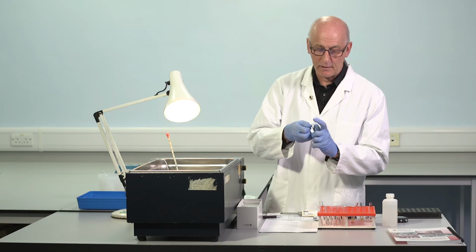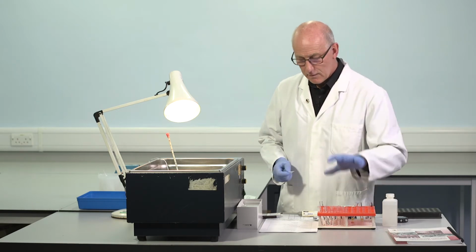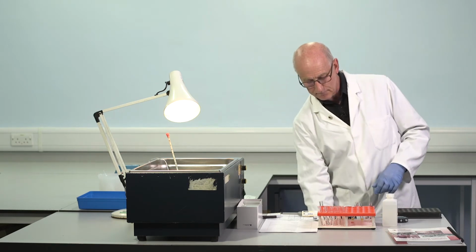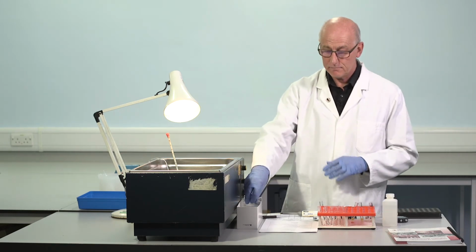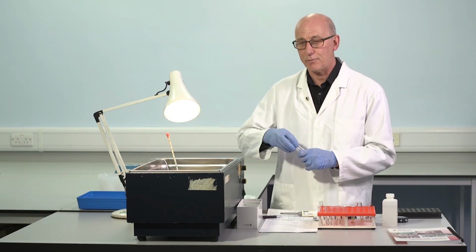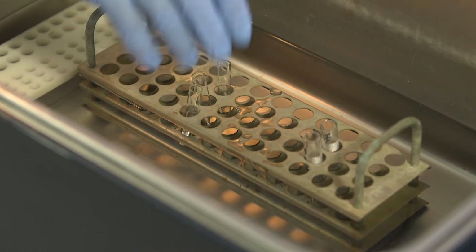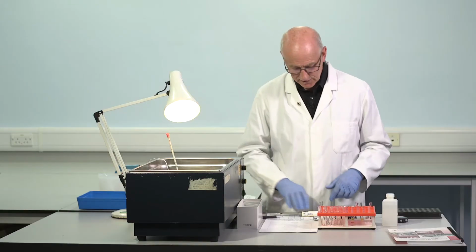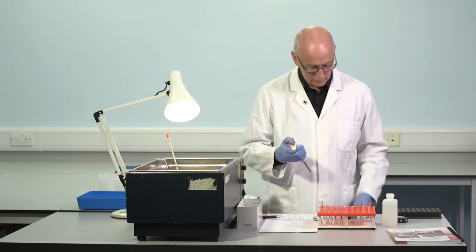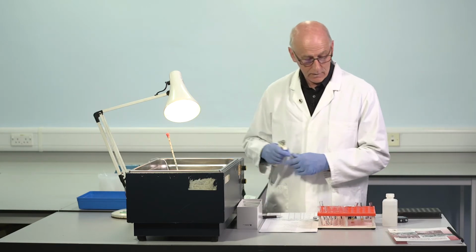To get good mixing in the larger volume, it's useful to make a tilt. So 3 different dilutions, 3 glass tubes, same glass tubes as the standard. We're always trying to treat QC and patient samples in the same way, as close as possible to the calibration material, the standard. Same processing, same conditions. So we should add the reagents and so on in the same order.